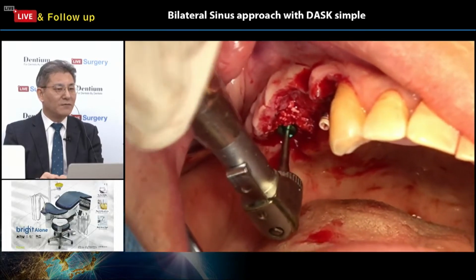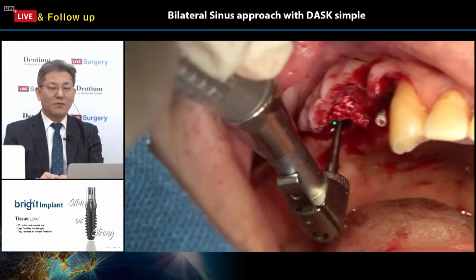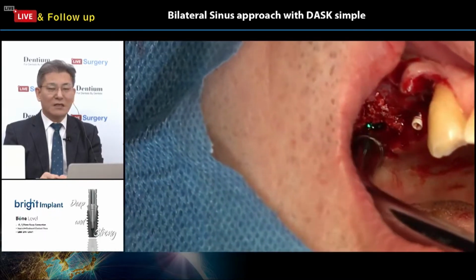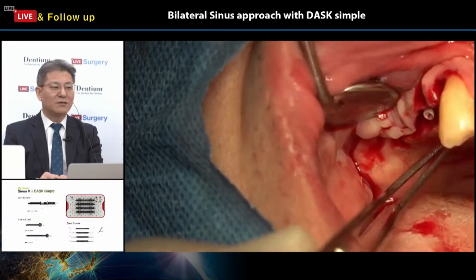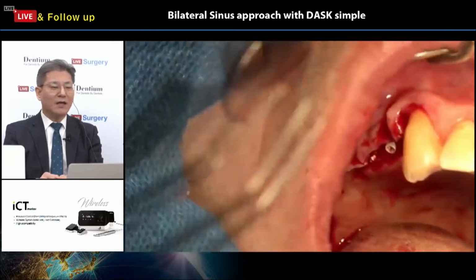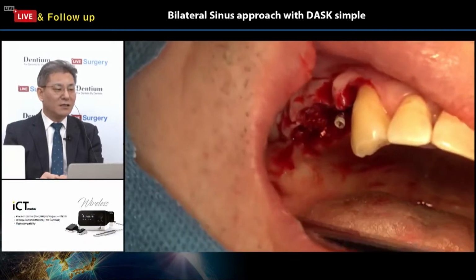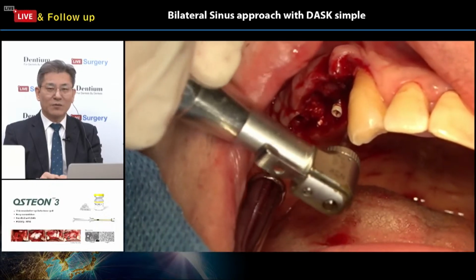Okay, 4.5 diameter and 7 millimeter. The bone level implant is inserted with the cover screw. And he didn't do any other bone grafting procedure on the labial portion.